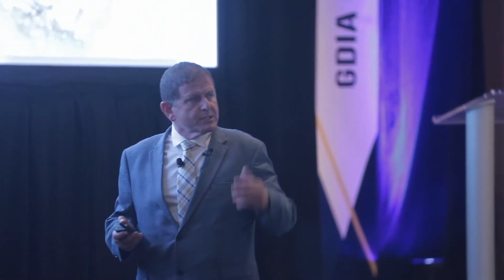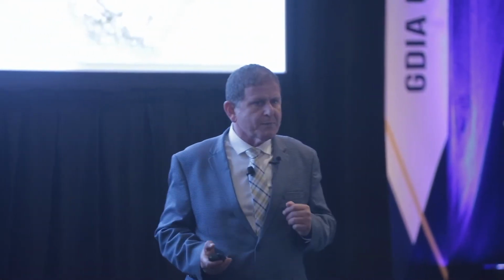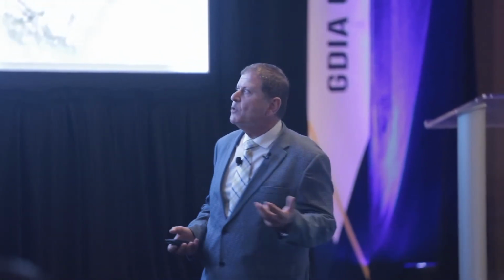Now, when we use a material that resorbs simultaneously with bone formation, it is actually a short-term space maintainer. And we know that if we want success in augmentation, there are two essential requirements. One is space maintaining, the second is graft stability. No matter what kind of graft we use, if we do not respect those two essential requirements, we will not have bone in that area. So if we are using something that is replaced even simultaneously with the patient's own bone, it's a short-term space maintainer. Therefore, sometimes we need to create a composite graft. A composite graft can be a mixture of two different augmentation materials, such as autogenous bone graft with xenograft, or any other augmentation materials with different behavior, in order to gain a little more vital bone in the area. So in the end of the day, we will have a much better result than this one.